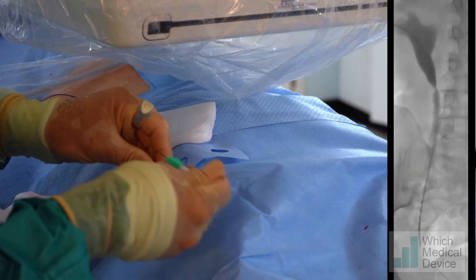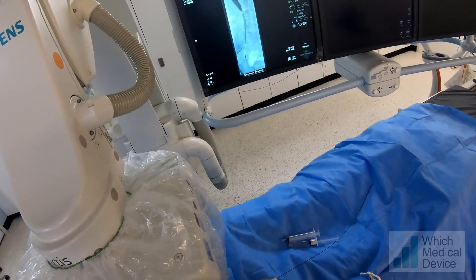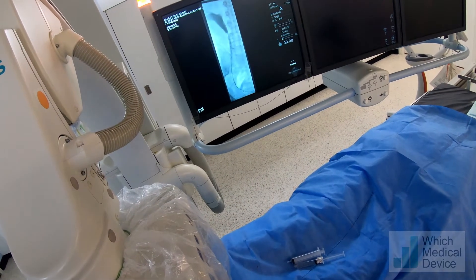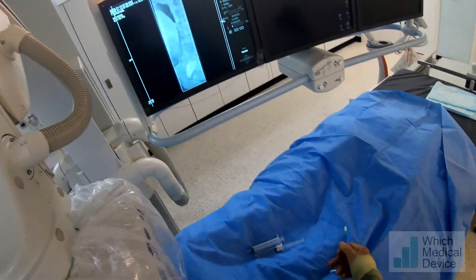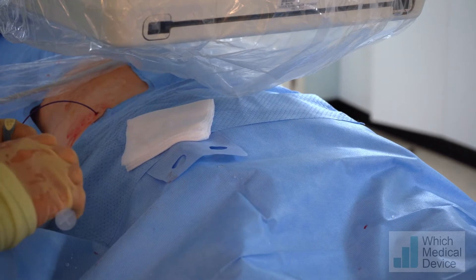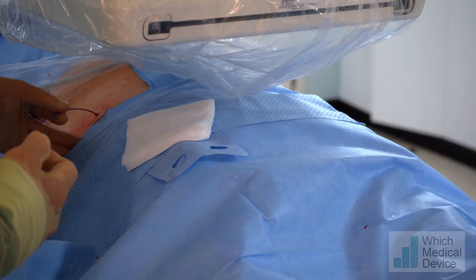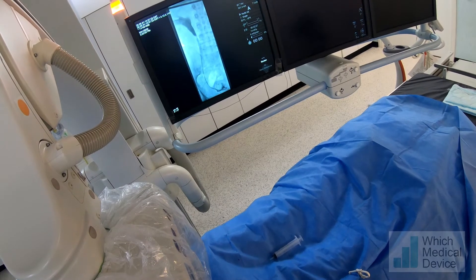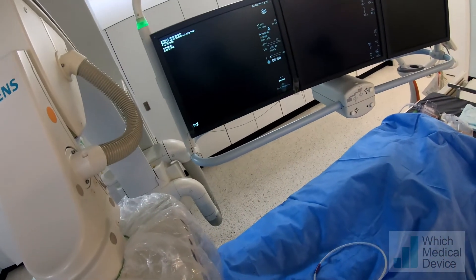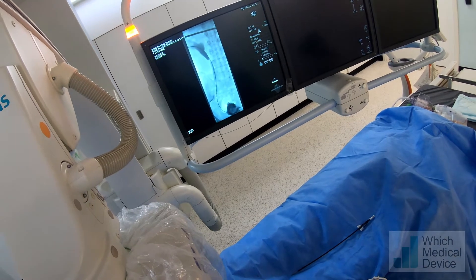I think we've just got through into the bladder — that was a little bit of forward pressure with the hydrophilic wire down at the level of the occlusion. We're now advancing the catheter into the bladder, then putting a bit of contrast in to confirm we're in the bladder. We then change for an extra stiff wire, which we pass down into the bladder to enable us to put a peel-away sheath in, followed by a stent.